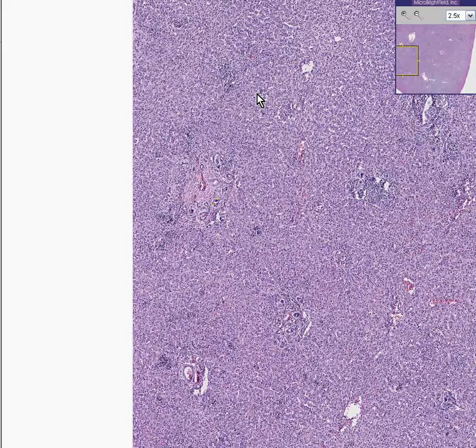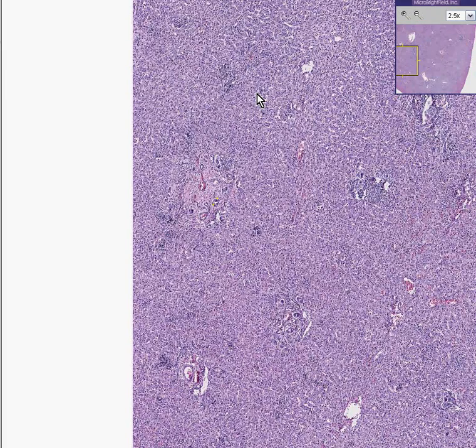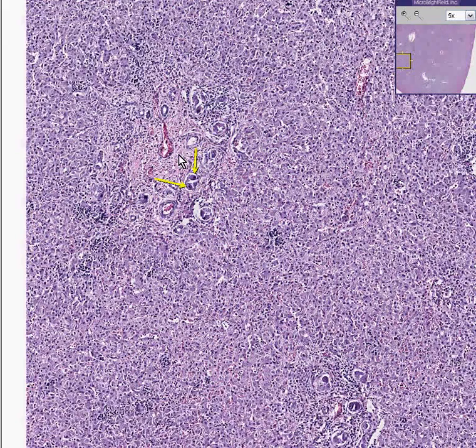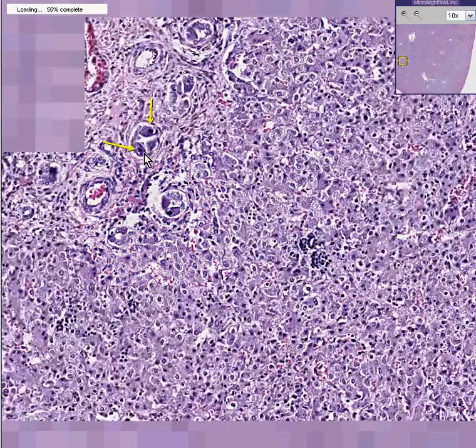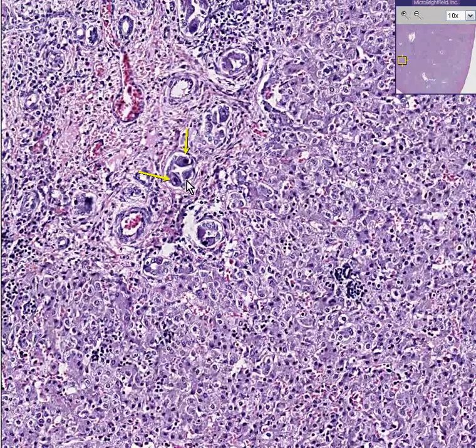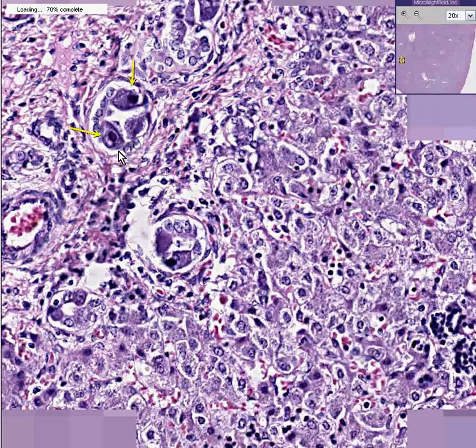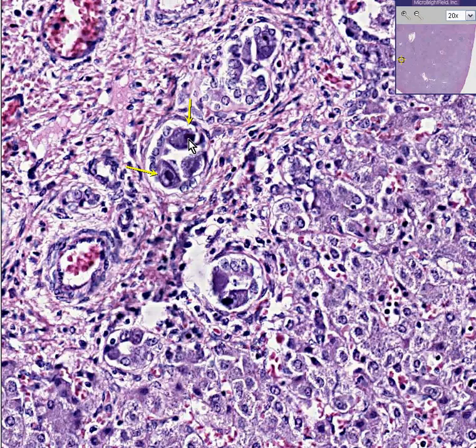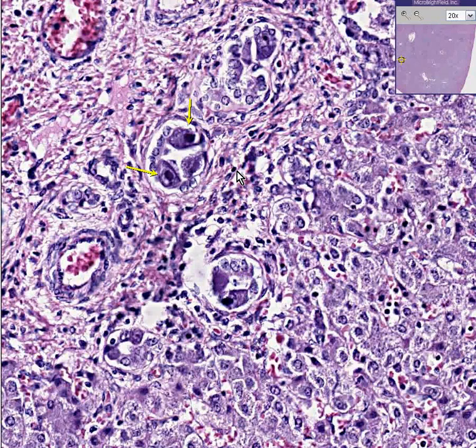and then you have this long list: adenoviruses, yellow fever, CMV, herpes, Epstein-Barr — whenever you see what is obviously a viral hepatitis and you can find cells like this at the tip of the arrow, which have very, very basophilic — not eosinophilic like herpes, but basophilic — intranuclear inclusions, you can diagnose CMV hepatitis.